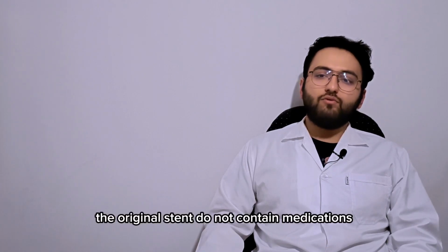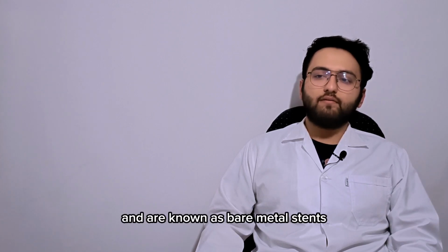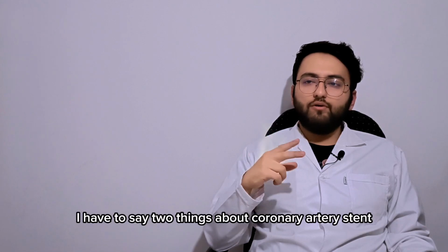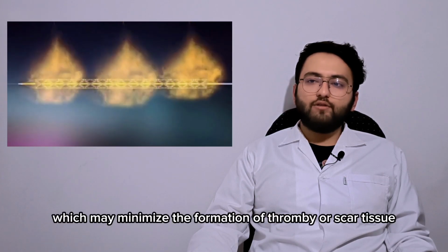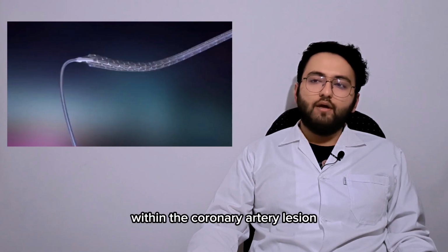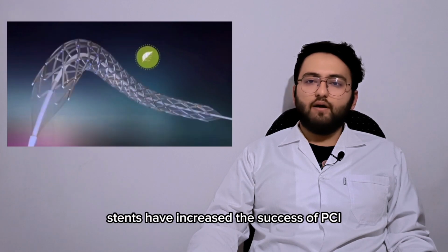The original stents do not contain medications and are known as bare metal stents. I have to say two things about coronary artery stents. First, some stents are coated with medications which may minimize the formation of thrombi or scar tissue within the coronary artery lesion. These drug-eluting stents have increased the success of PCI.